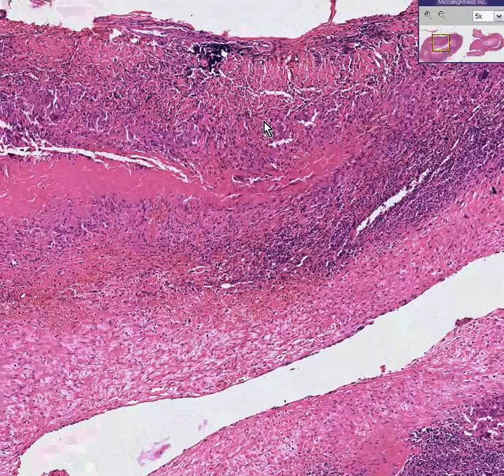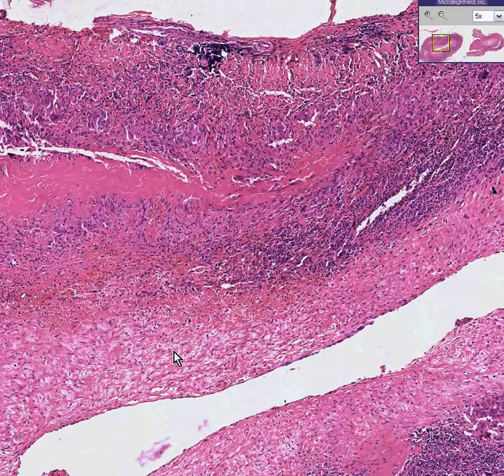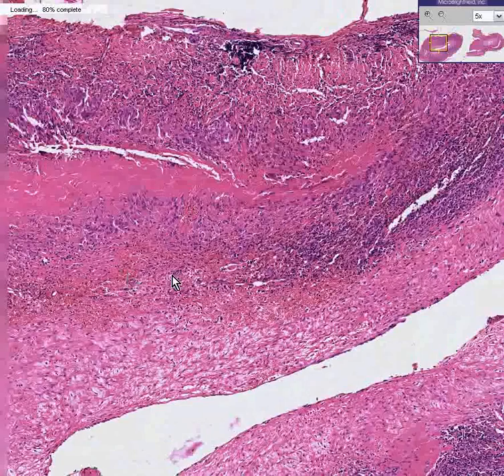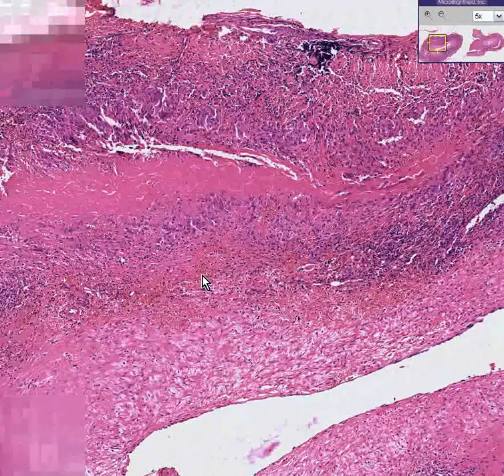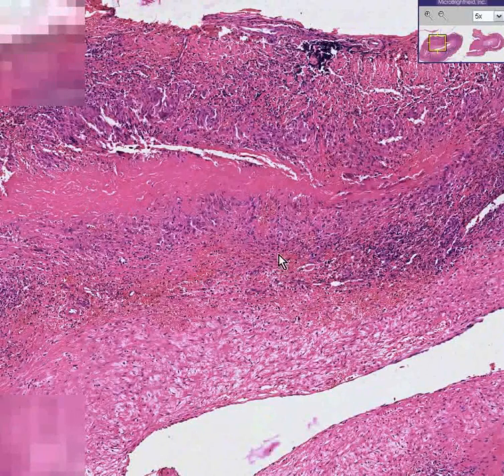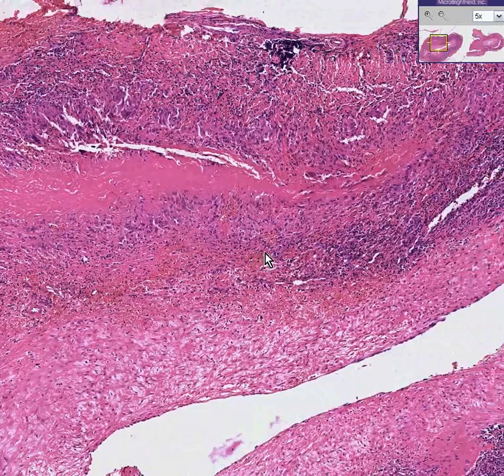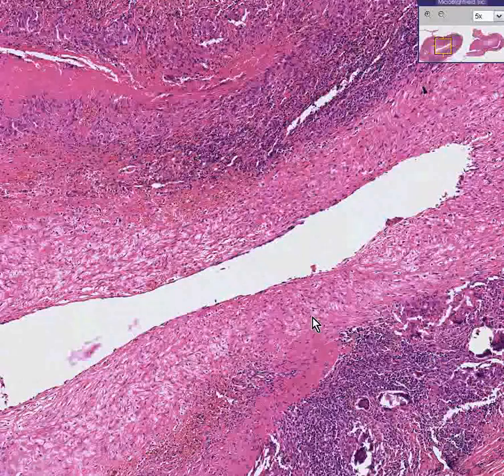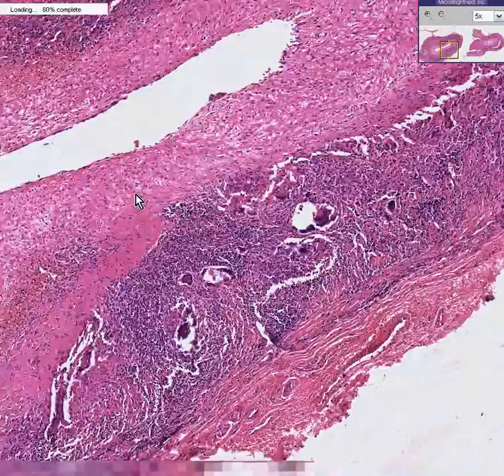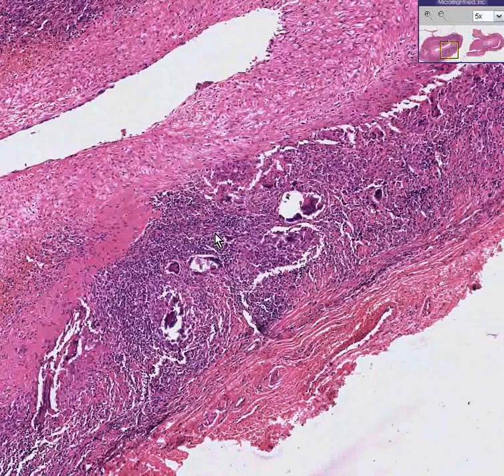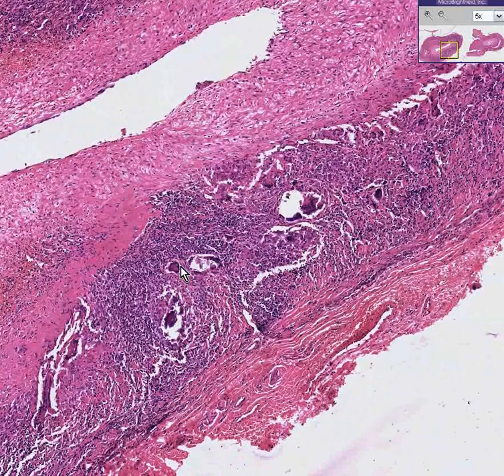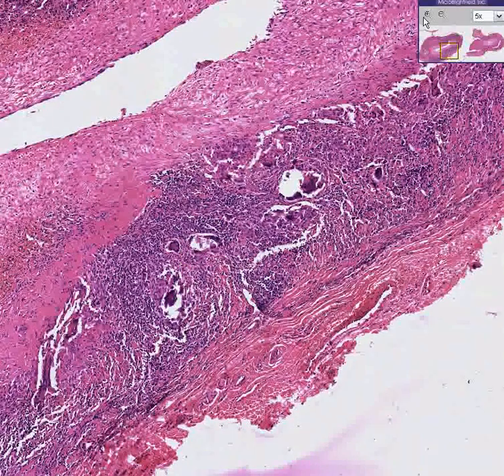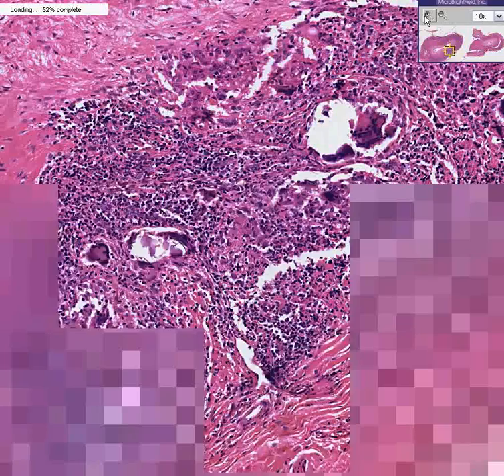You can see disruption throughout the entire thickness of this artery, as well as some areas of fibrinoid necrosis. In addition to this chronic inflammatory cell infiltrate, you don't have to look very long before you see another type of cell.